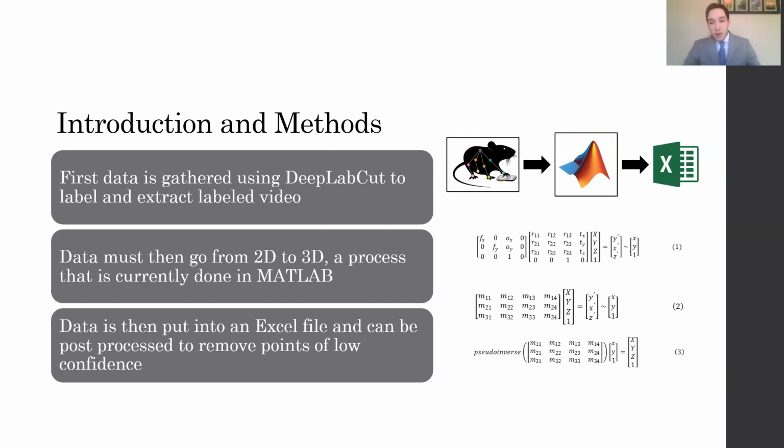A number of steps, step lengths, step quality, all of these things could be quantified. And there's a necessity to quantify them both in clinic and outside of a research setting without the need of expensive and detailed equipment. And so that's sort of the purpose of this. For our study, we looked at DeepLabCut for that, which is an open source program that uses deep learning to label points from videos.